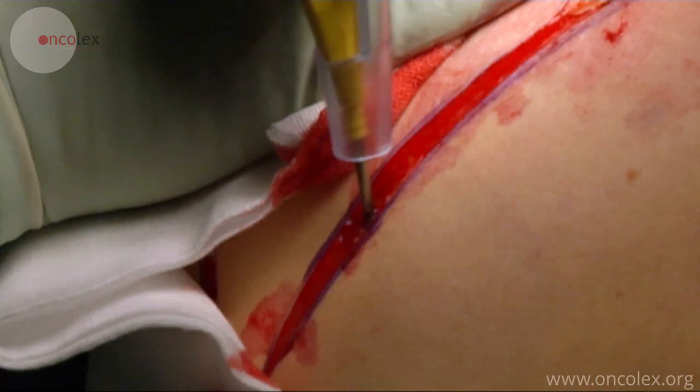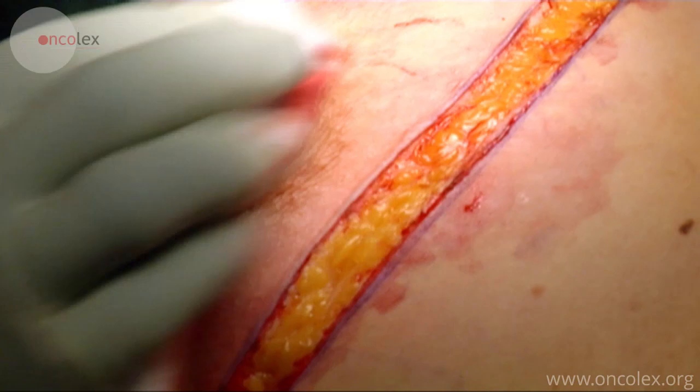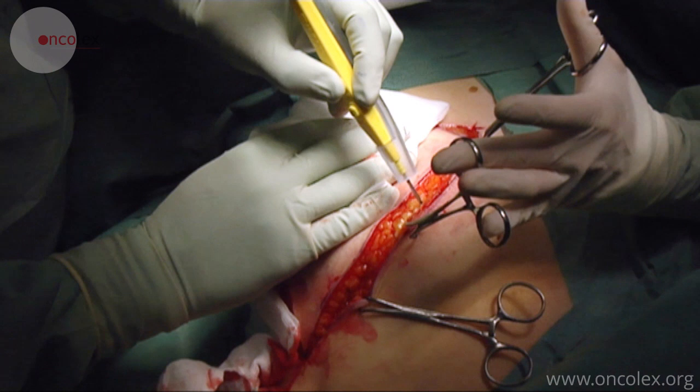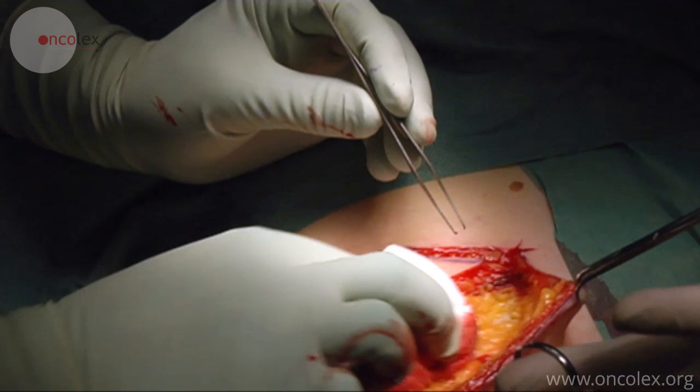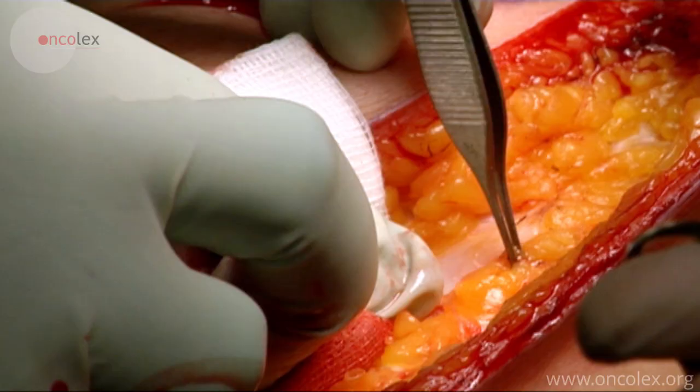Using diathermy, the mammary gland is dissected from the surrounding tissue down to the pectoralis major muscle. The skin is held taut during the dissection to avoid perforation. Thorough hemostasis is carried out continually.